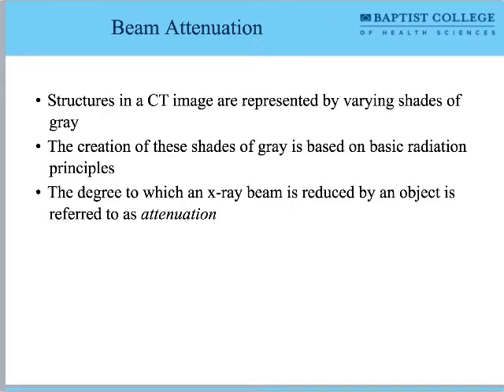In most clinical settings, like where I'm at now, there's a GE, and I know they use the term scouts. But let's say the next clinic that I go to has a different type of CT. Will they still sometimes use the word scout? They probably will. Is it something that's embedded in their programming, so you have to go with it? It is embedded in the programming. When you're working on the GE scanner, it says initiate scout. If you're on a Siemens, it says scanogram or something ridiculous like that.